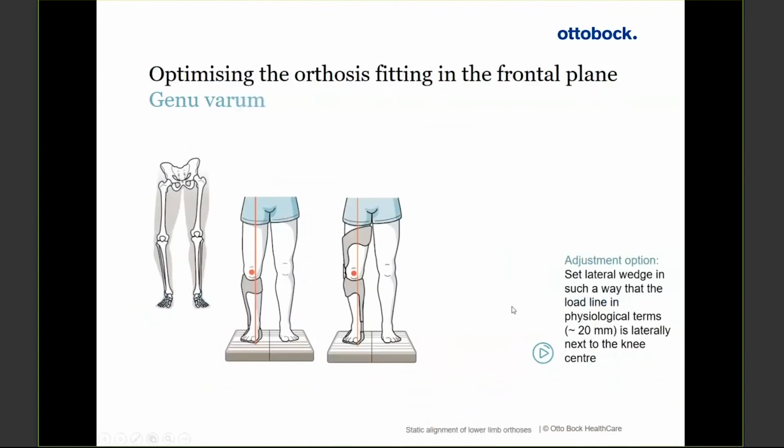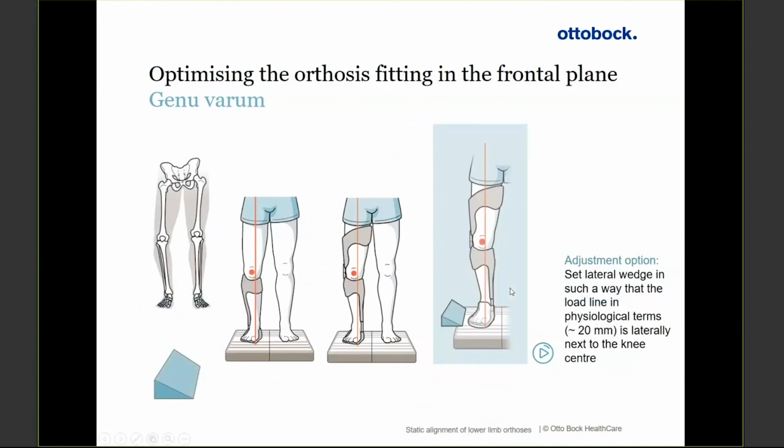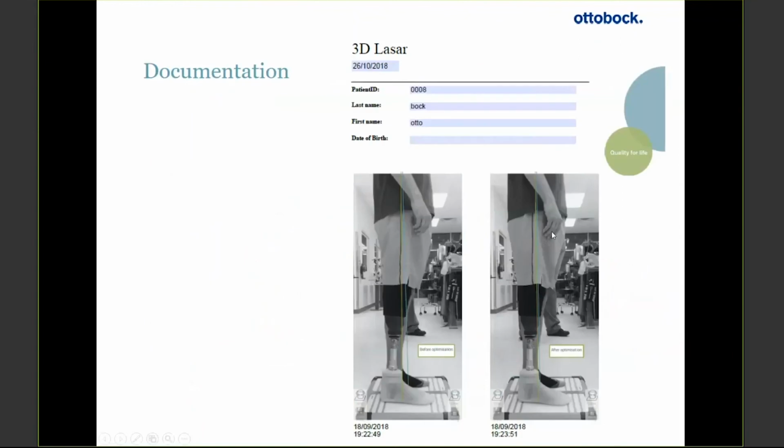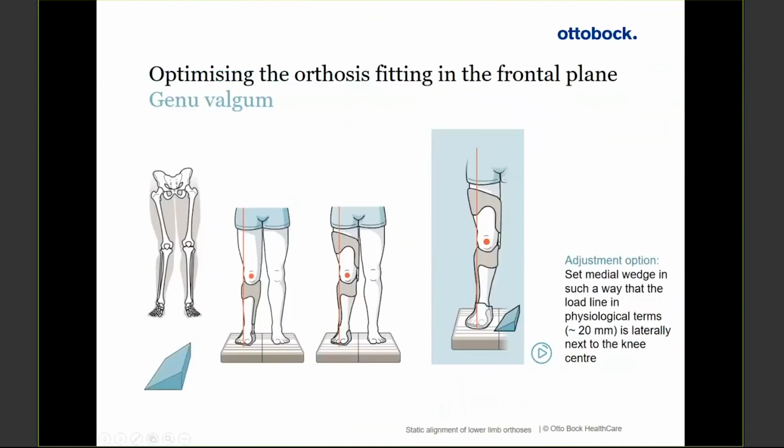This also helps us set corrective wedging, right? A lot of times we'll just kind of guess based on our qualitative knowledge of orthoses, but if we can place the wedge, we can actually see what the effect has been rather than asking the patient, oh, what do you think of that? And normally they just kind of say, well, I don't know, it's different. But now we can actually see, well, okay, that's exactly where we need to be. Okay, the next one, please. Yeah, we can do a medial wedge or a lateral wedge and really establish that well.